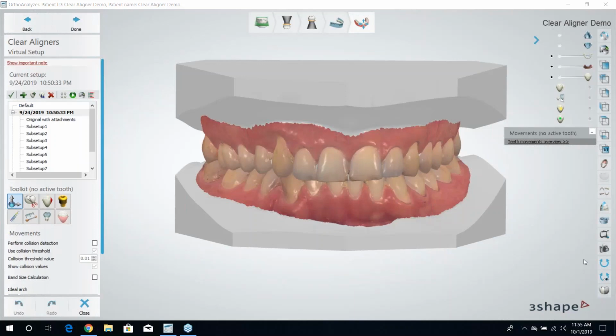I showed you what Invisalign costs. I think doing it this way, we can offer patients a more cost-effective solution. I will say that.